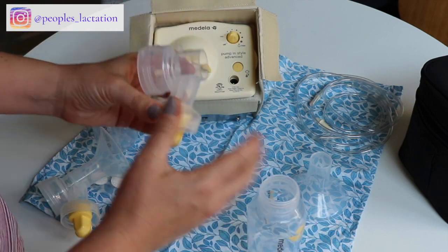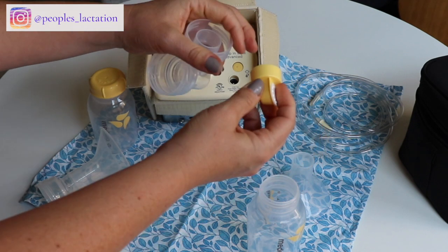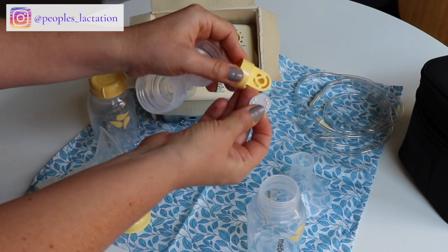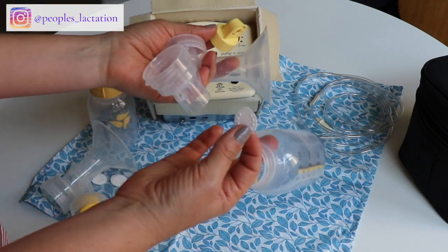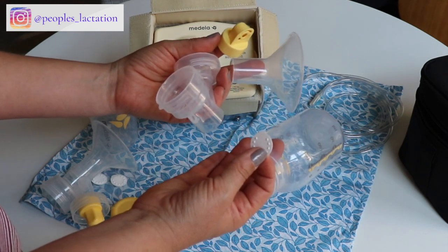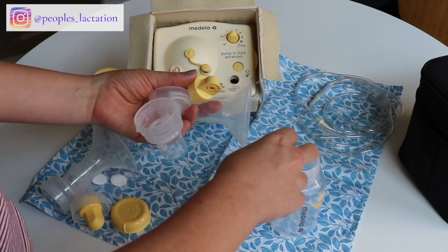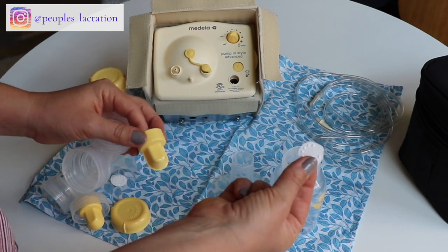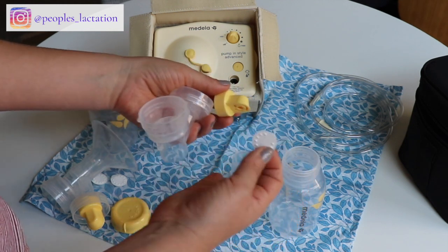When you take this apart, each side is going to have five pieces: your bottle, your flange, this yellow piece, and this little white flap also comes off. In order to wash this, each side comes apart into five pieces and you rinse it in warm soapy water after each use. You do want to sterilize your parts once a day. Everything except for the little white flap is dishwasher safe, so you can put any of the hard plastic pieces into the dishwasher.